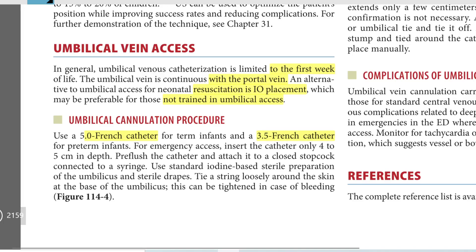For emergency access, insert the catheter only four to five centimeters in depth. Pre-flush the catheter and attach to a stopcock connected to a syringe. Use standard iodine-based sterile preparation of the umbilicus and sterile drapes.